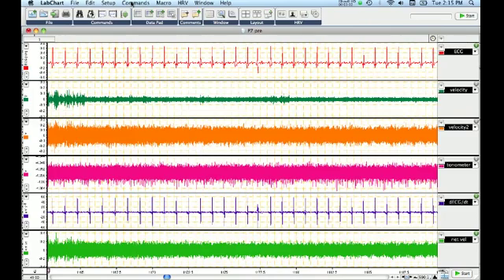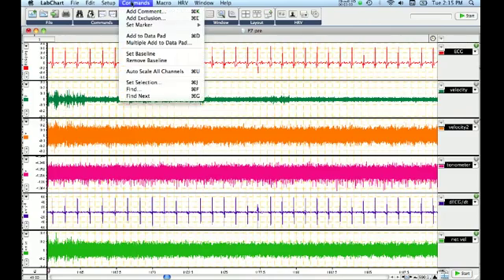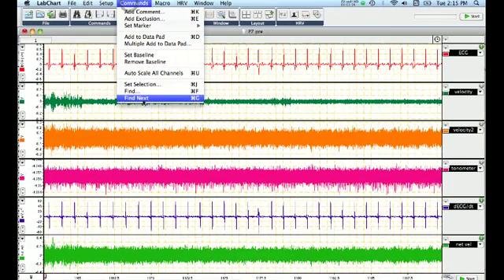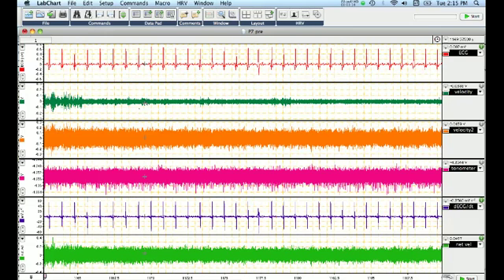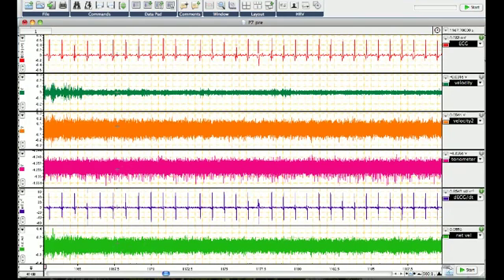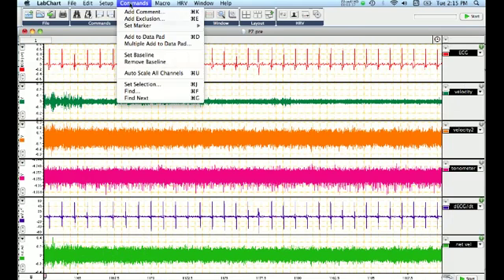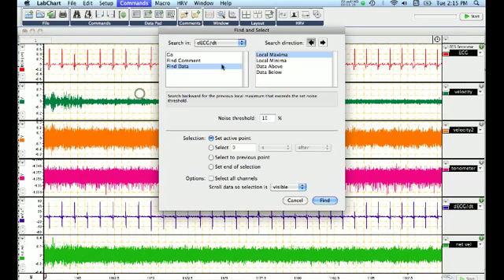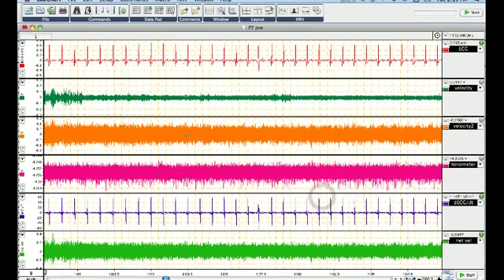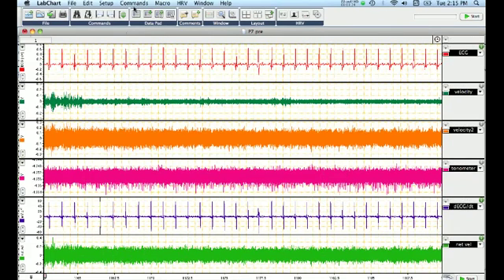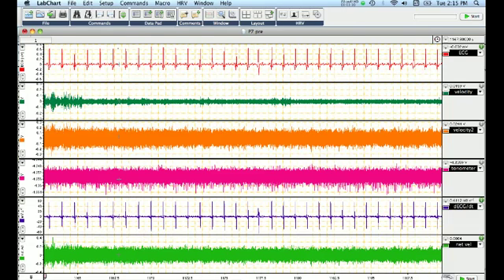I'm just going to test that on a number of beats by moving forward to the next particular spike by clicking Find Next. And by clicking Find Next several times, you'll notice that the spike in this case is actually moving backwards. But if we go Find in the forward direction, 10%, you'll notice that each time I do that, the cursor moves from one point to the next R spike.